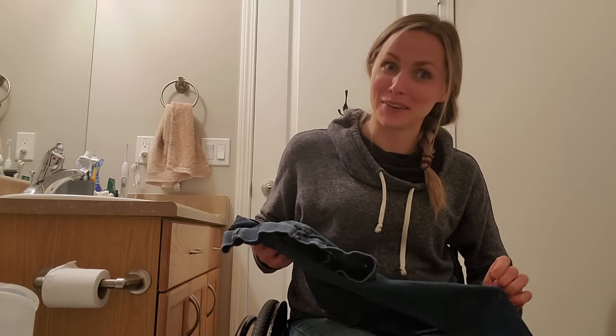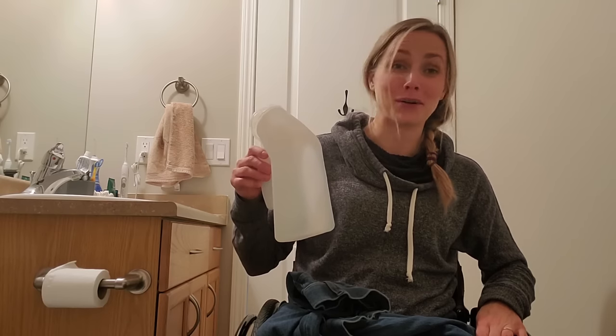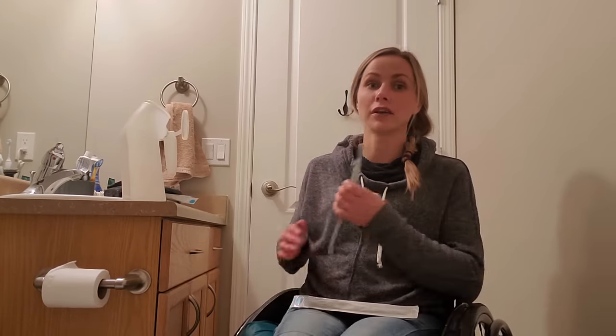Before I demonstrate, I want to warn you that I was originally going to show actual urination in this video. I did film it, but you could see a bit too much, and filming from behind was also awkward. So instead I'm going to explain the technique and go through the motions without actually peeing or unzipping, to avoid any accidental exposure. If you are uncomfortable with the concept of seeing urine come out of a catheter into a container, you may want to skip ahead.